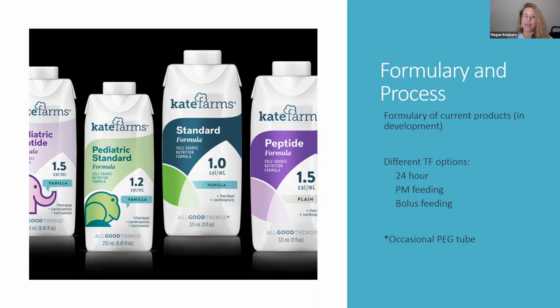The other thing could be PM feedings. So they're eating throughout the day, the tube is just taped up, they don't have a bag, they don't have a pole, they don't have any of that stuff, and they're eating, and then at night, after they're getting ready for bed, they're hooked up and they get, you know, a 10-hour feeding in while they sleep. So that's an ideal option. Another could be some bolus feedings where as an enhancement of a meal that they've had, or even in between meals and snacks, we could do a few ounces bolused in here and there. I think that would happen a lot less commonly, but it is an option. Again, I had already mentioned there is a potential for an occasional peg tube option, but we wouldn't place that. That would be something that would come to us. But again, not a big worry.